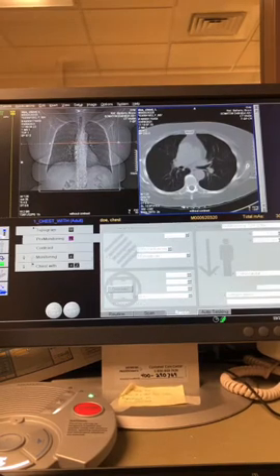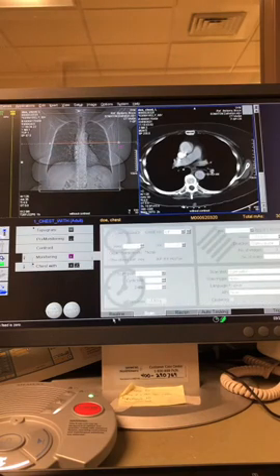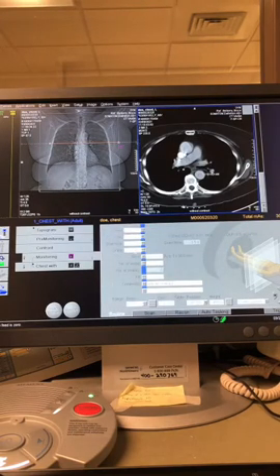And then the monitoring, if you click here, look here, is going to count down, let's look, 10 seconds. You can see delay 10 there. Maybe you can, maybe you can't, but it says 10 seconds under the delay right there. It's going to count down 10 seconds while the injection is going in, and then it's going to begin to take pictures right in this location.